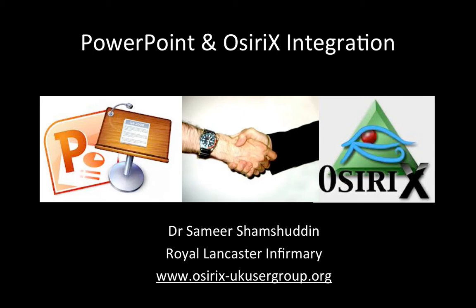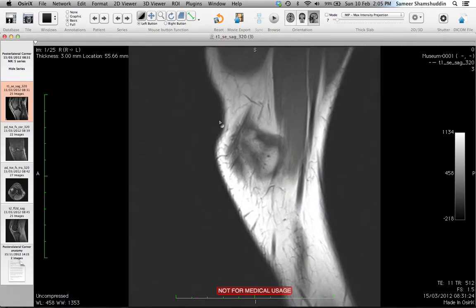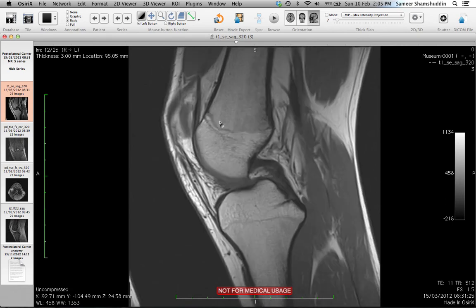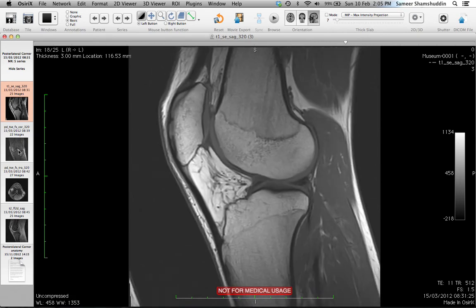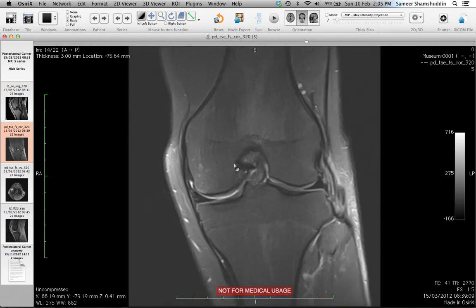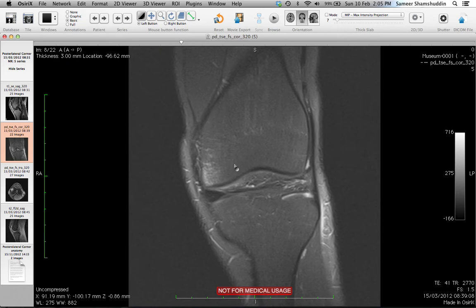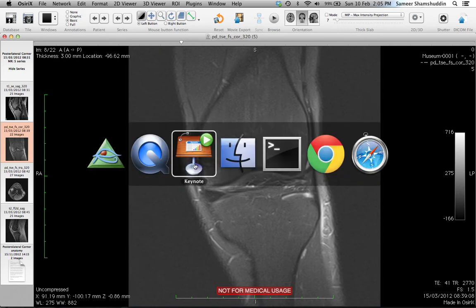This is a demonstration of cases showing how it's going to work. As you can see, if I click on Case 1, that will automatically launch OSRx and bring up the case. During your presentation you can scroll through the stack of images, window, zoom, pan, and do whatever you want using OSRx. To go back to the presentation you need to click Command and Tab together and select Keynote.